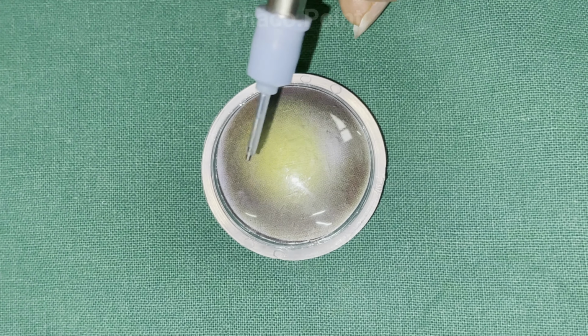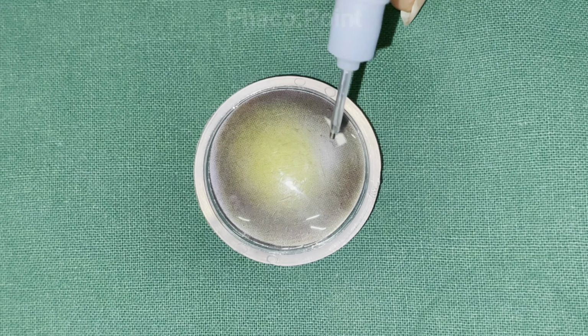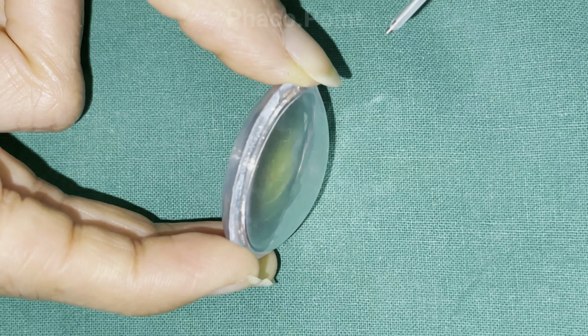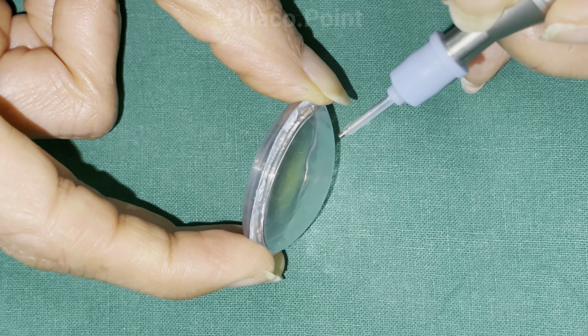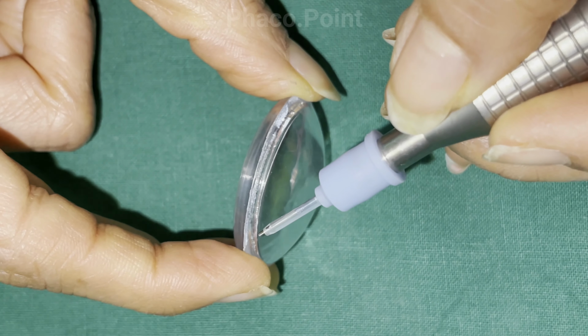So once more we come to the model eye, wherein we assume this is the pupillary edge and the rhexis edge. Now where would you start your chop? It's very important to note that the nucleus is a biconvex disc, and therefore, to be able to get to the absolute depth, I would prefer that the surgeon start the chop not in the center, because if they started chopping in the center and went down, they would almost reach close to the mid-periphery.